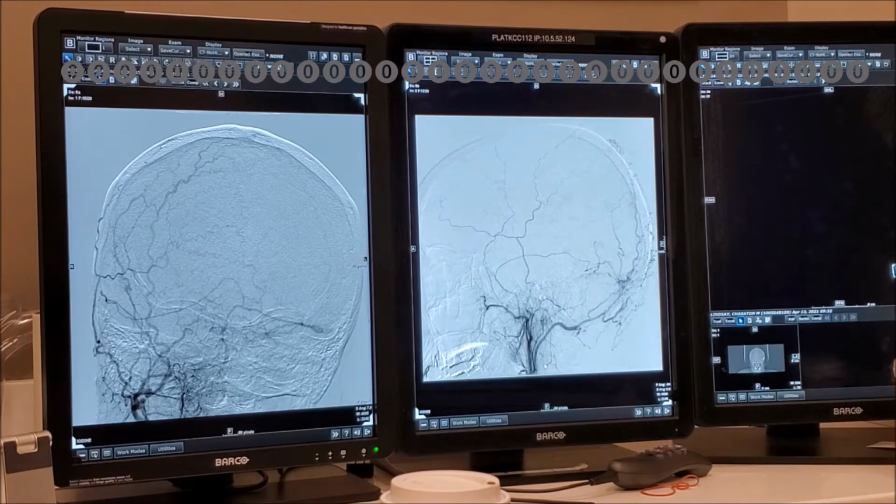Could you tell me where the hypoglossal foramen would be? So the neuromeningeal division. This is the neuromeningeal branch, right? So where it straightens, somewhere around here. Yeah. Okay? So this is a nice demonstration.